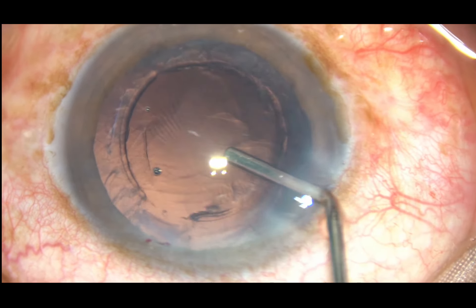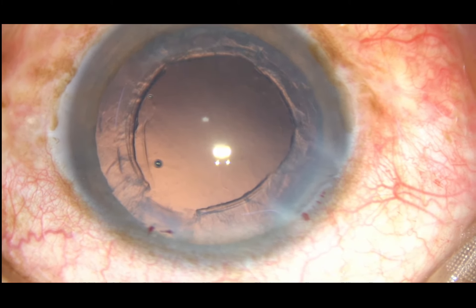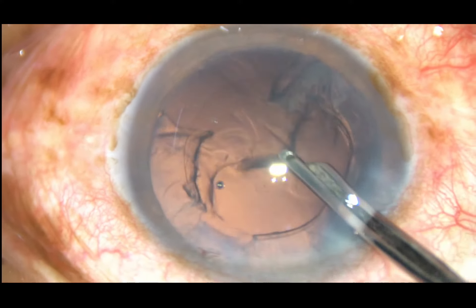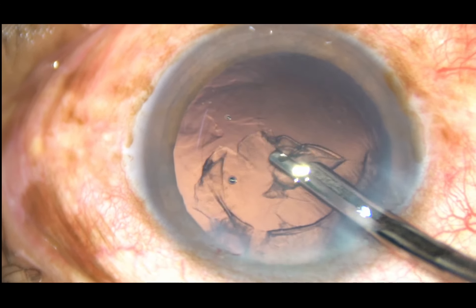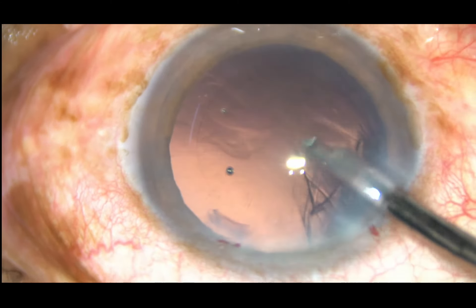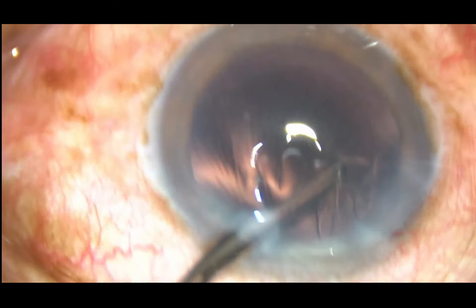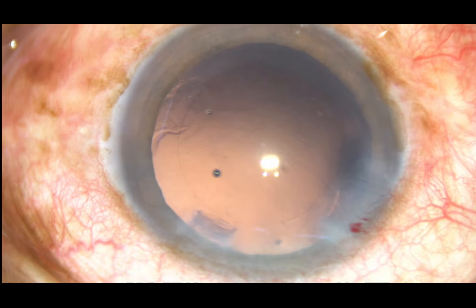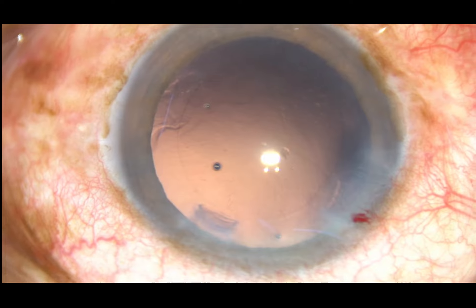Since there is only one side port in this case, you have to use either a Simcoe cannula or a coaxial irrigation-aspiration cannula. I am using a 23G Simcoe cannula and very easily we can remove the cortex with this simple instrument. For every case you can afford a Simcoe cannula, but bimanual and coaxial can be difficult to afford if you are a very high-volume surgeon.